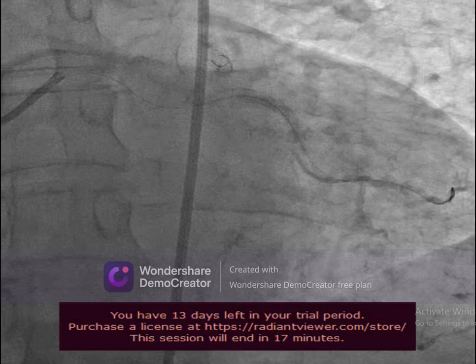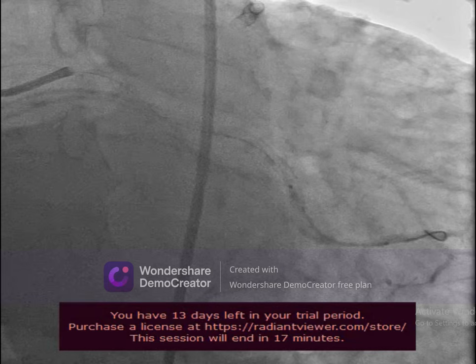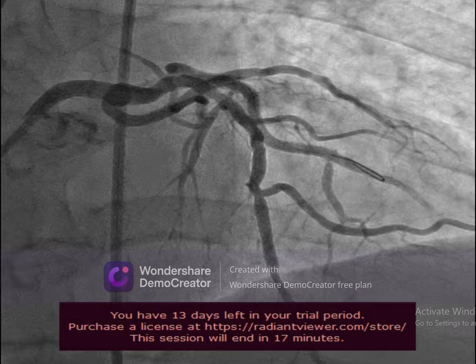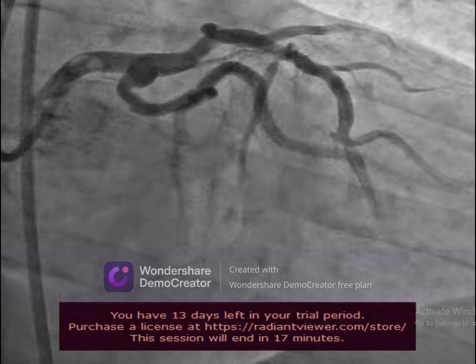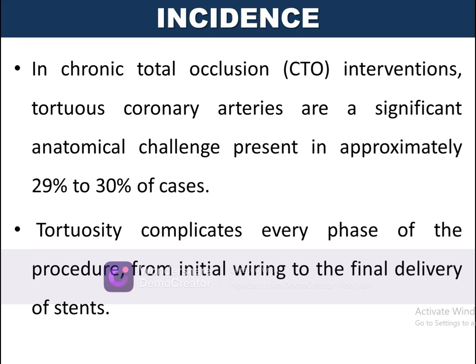And as you see here, finally the architecture of the artery was clear, but there was a dissection distal to the stent, and I started to put a stent distally. And as you see, finally this is the final result, a very big OM with distal branching.